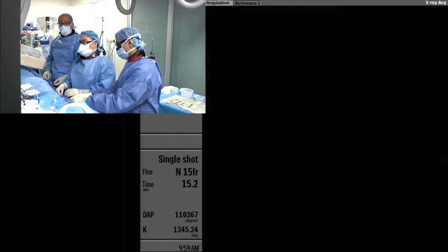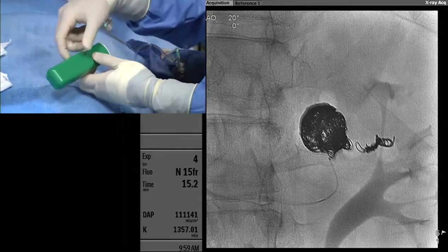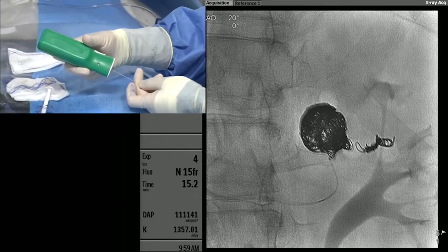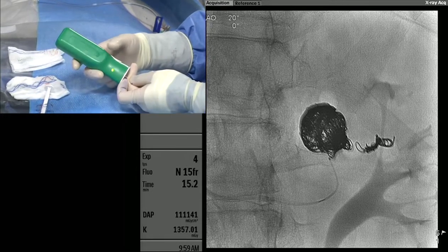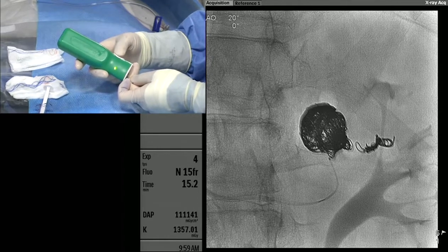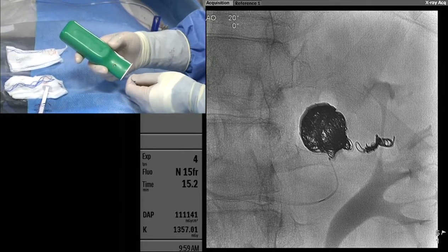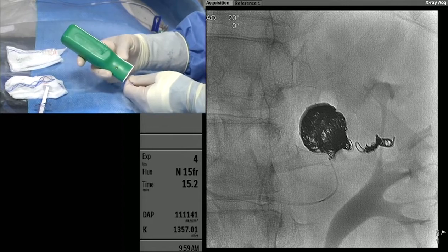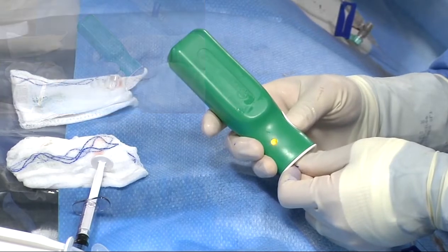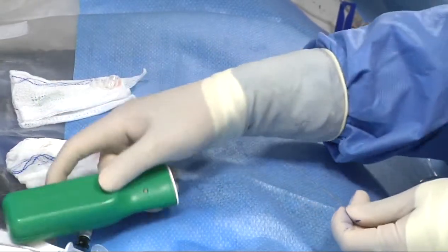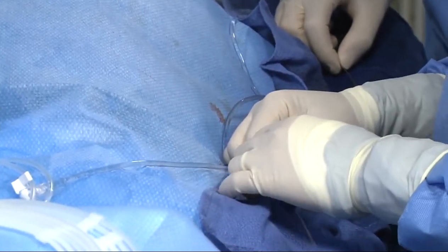The handle takes the back end of the pusher wire and you get feedback from a light showing it's engaging with the back end of the wire. By pressing the button it tells you when it detaches. There we go — and now you'll see under fluoroscopy when Ed retracts the wire.